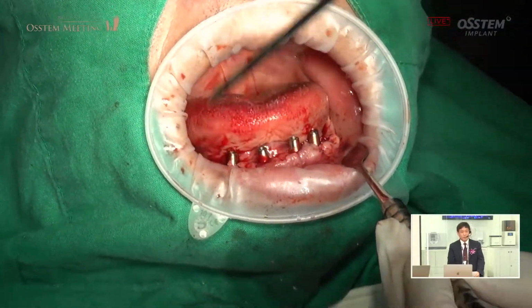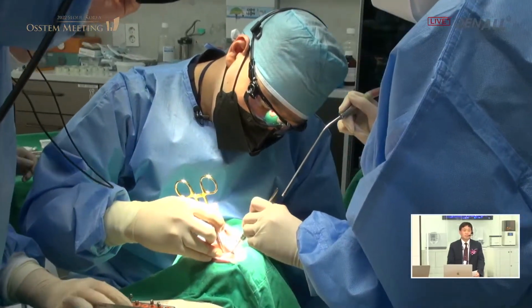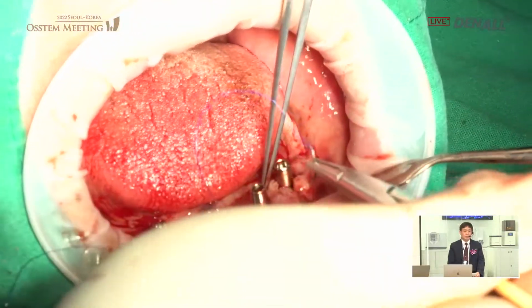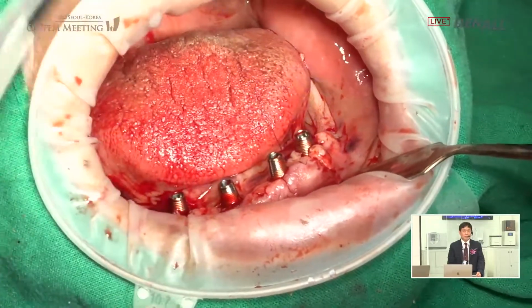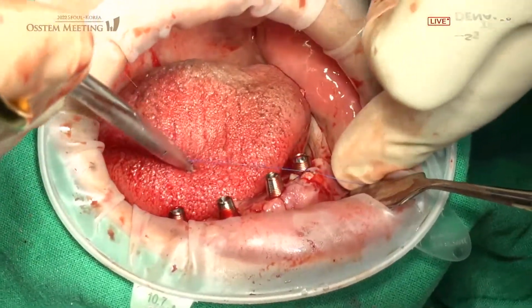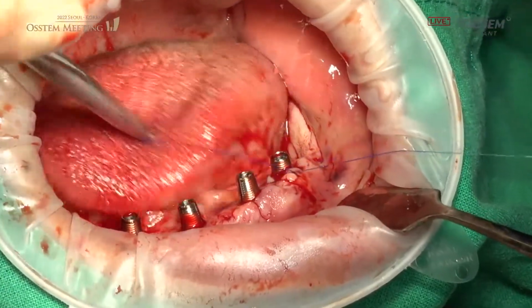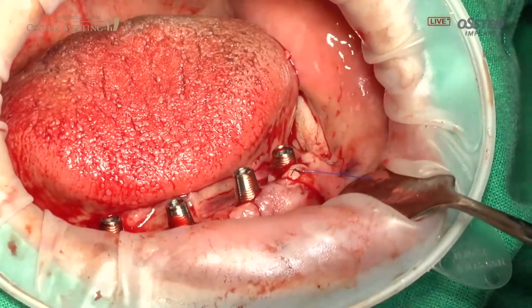You tried it in. Do you think it fits nicely? Yes. I believe it has been placed in the planned position. When the implant placement depth goes in very slightly deeper than the planned position, it can go in slightly deeper. In this case, there can be a gap with the prosthesis.